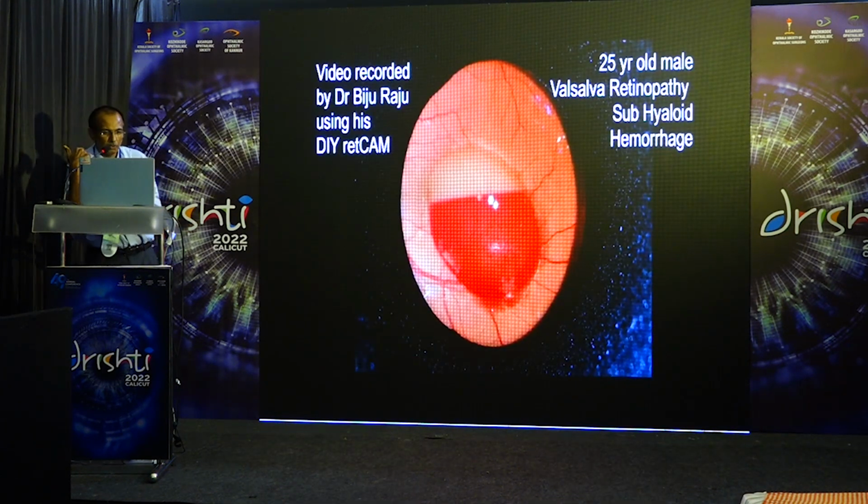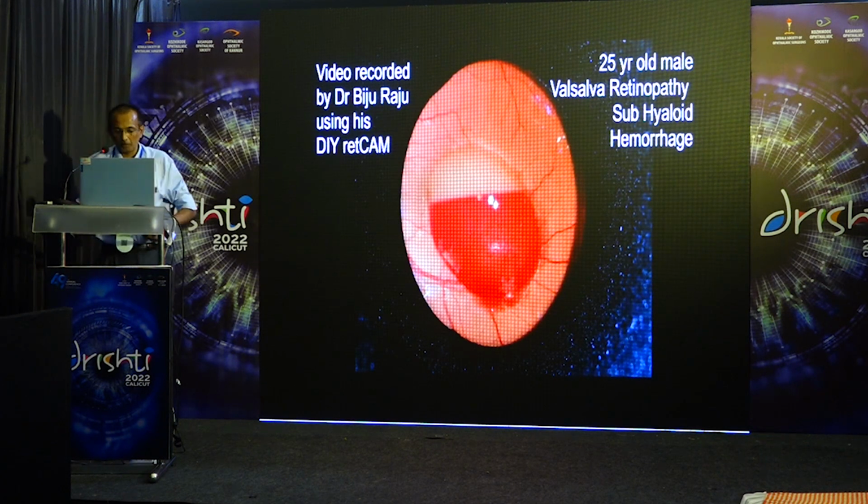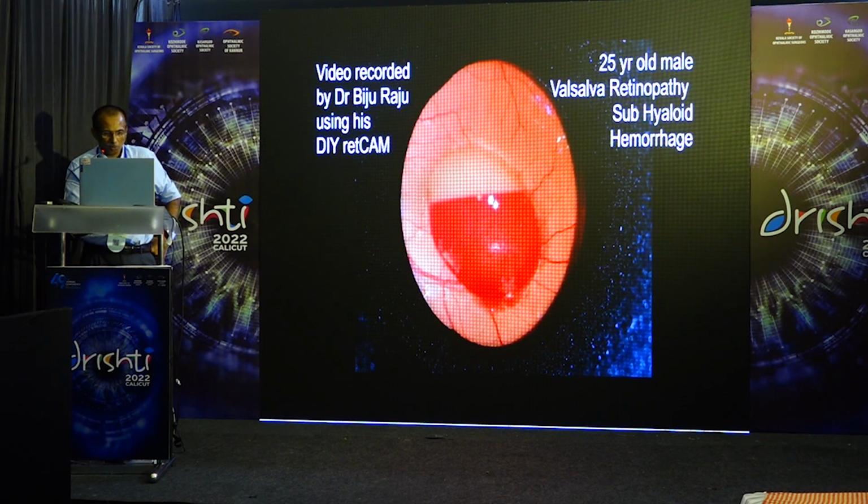So this is a video. We don't have a video attached to our laser, so I borrowed it from somebody who has my name. This was actually recorded by Dr. Biju using his do-it-yourself retinal cam. You can see it has already been an attempted laser.